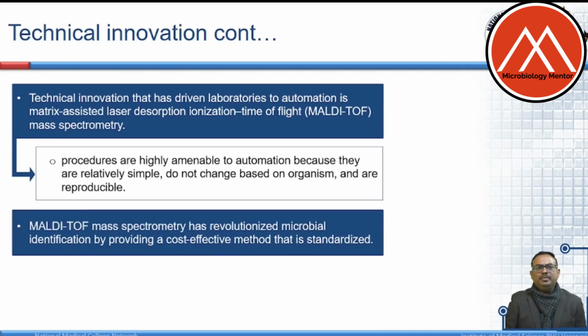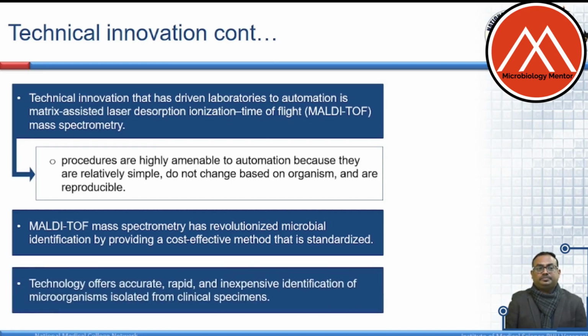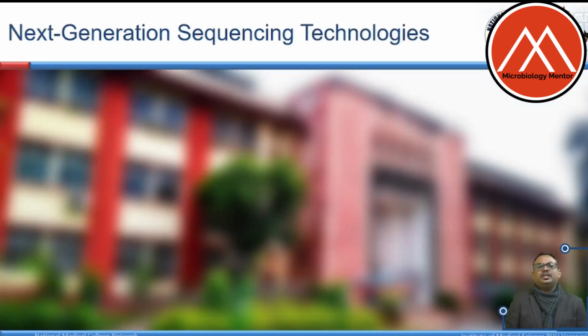At the same time, they have revolutionized the microbial identification by providing a cost effective method that is also standardized. So this technique offers accurate, rapid, and inexpensive identification of microorganisms which can be isolated from the clinical specimen.